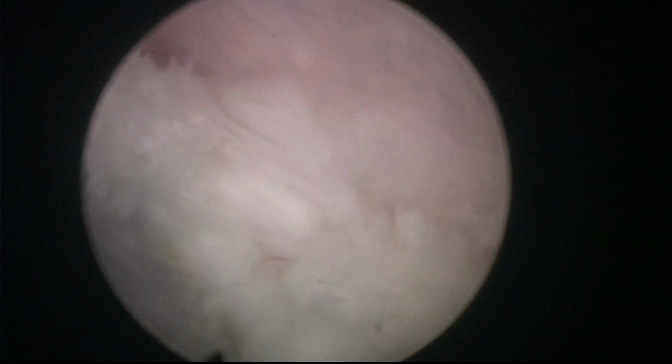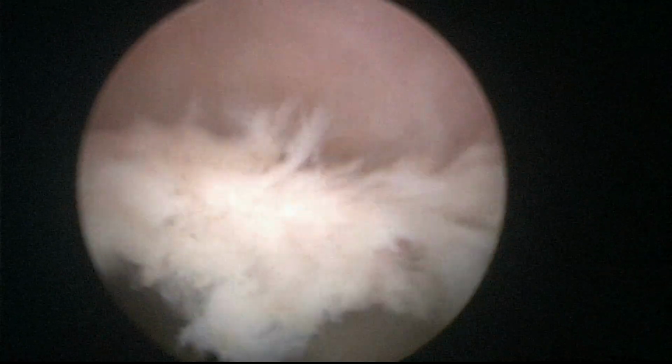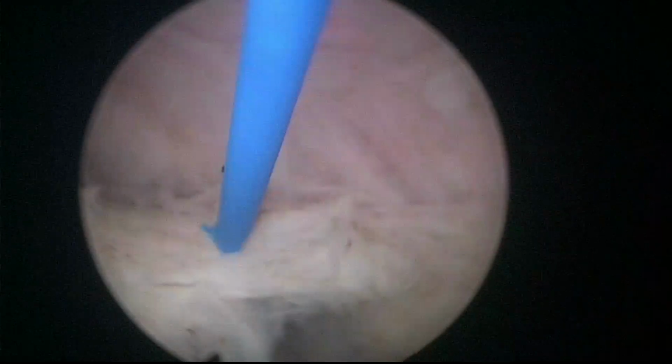If we look anteriorly, it's pretty good. There is maybe a little, let me leave the fiber a moment. There's maybe a little bit of tissue around here that we're going to just remove now. I think it's going to be easier to finish that. I didn't see it before. But otherwise, very good. This is some anterior near the sphincter tissue, but I don't think that's obstructive.